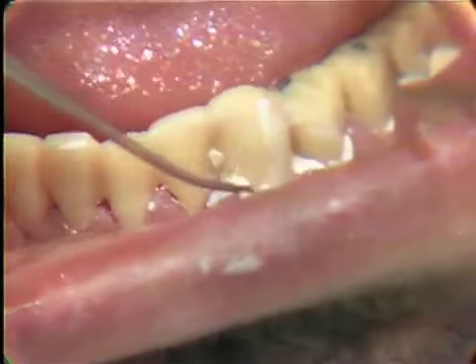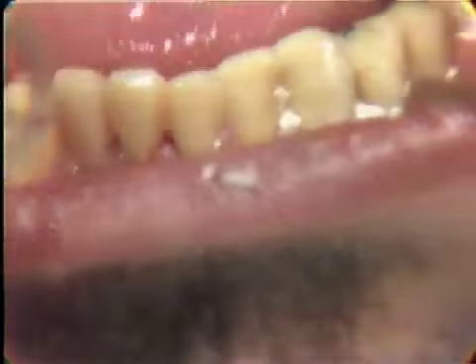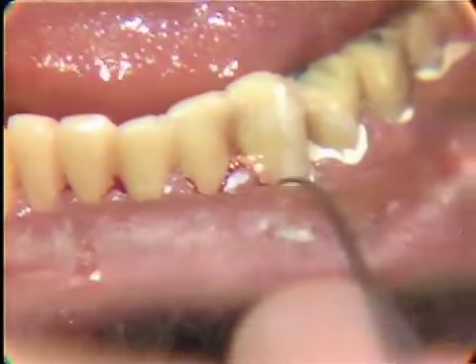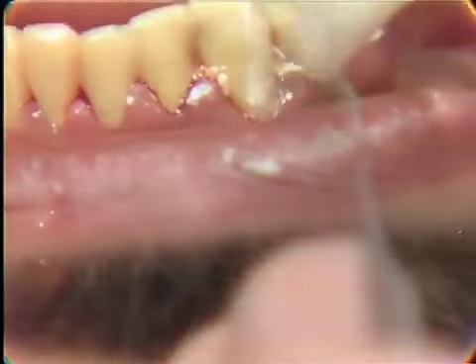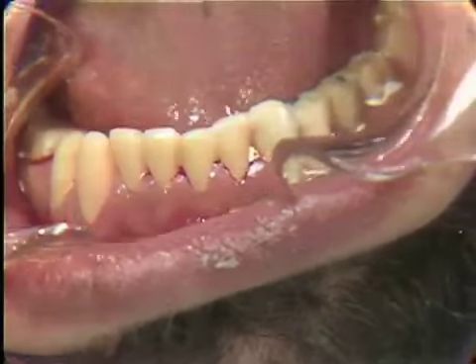Temporary material left in the sulcus could irritate the tissue and cause inflammation. So we can go ahead now and clean out the rest of the temporary cement.